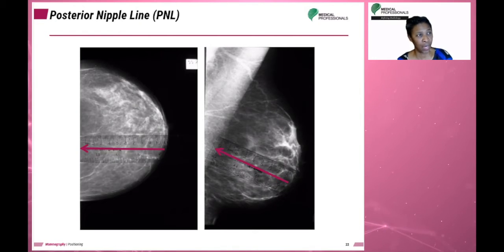They may do an ultrasound, for example. They may ask for spot imaging, mag imaging. Once that workup is concluded, they may even go further with MRI to determine, is this something real? With 3D imaging now, that oftentimes gives the radiologist a lot more information. So depending on what is found, then the decision is made.